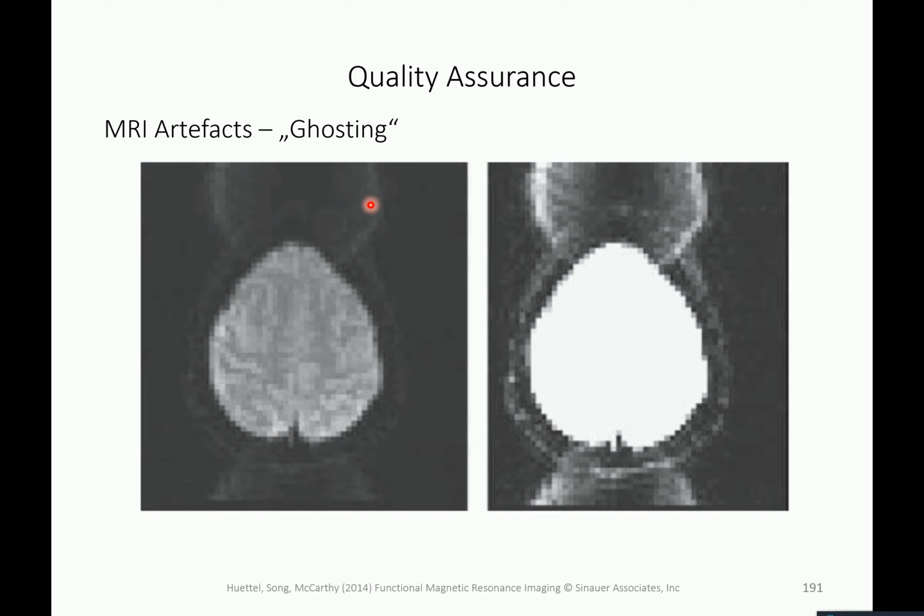This actually has to do with aliasing in terms of the image reconstruction and the frequency stuff that we discussed last hour. It's called ghosting because you have here the image of the brain at the top of the head, roughly, an EPI image, and you see that there is kind of a wraparound of data points. If you emphasize the image, you see that here again, and you have the front of the brain here. So these artifacts are called ghosting.